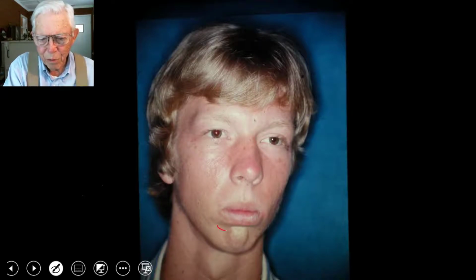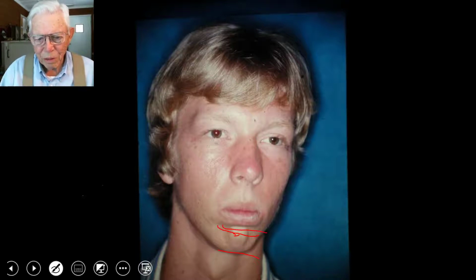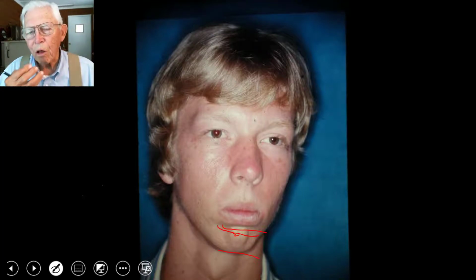So here this young guy is, and he's got about 3/4 of an inch of excess facial height in here, and this going down, even though he has not developed a chin that's long enough here. If this was a class 3 case, it's still going down like that. So let's get on here with it a little bit.